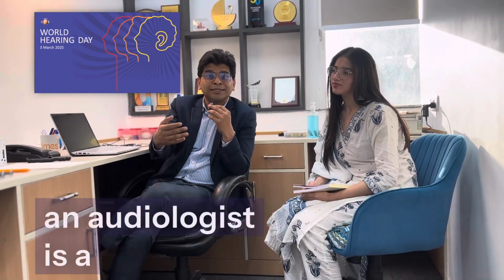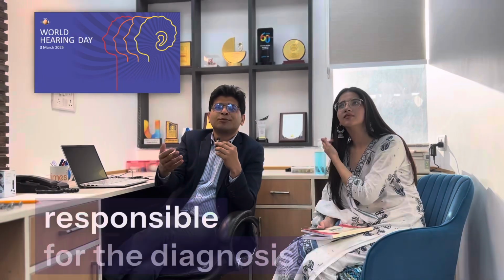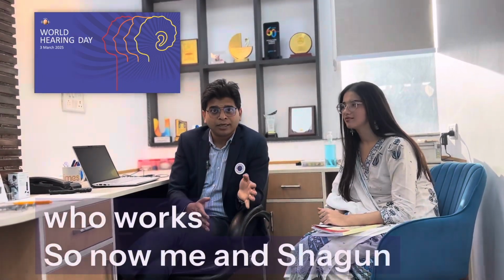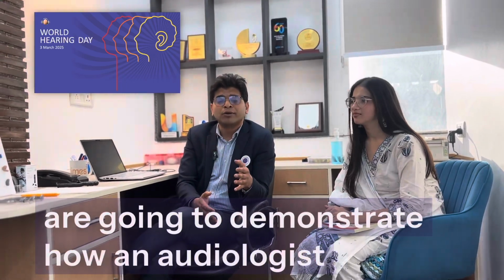An audiologist is a specialist who helps you with your hearing loss, and he is responsible for the diagnosis, who works independently. Now Shagun and I are going to demonstrate how an audiologist works.